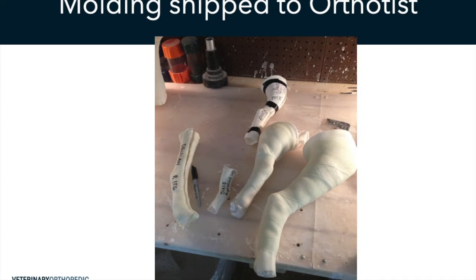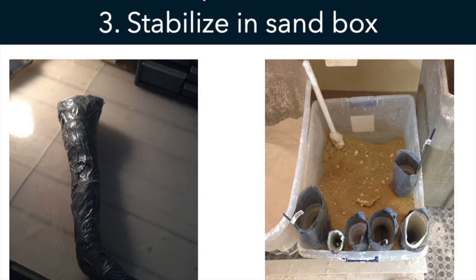So we have the mold that's shipped to the orthotist. In this case, it's going to be with Derek Campana. And then what we have here is we have duct tape to seal the mold, and we're going to stabilize this in a sandbox.